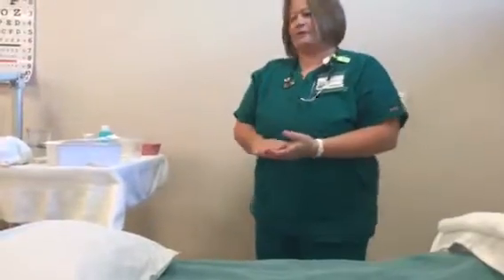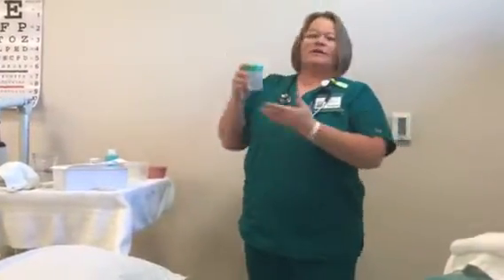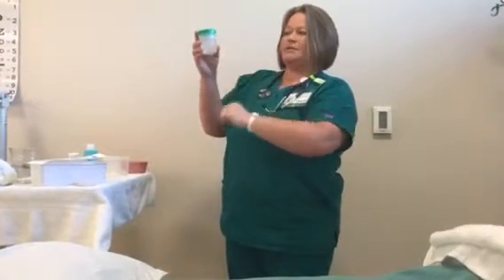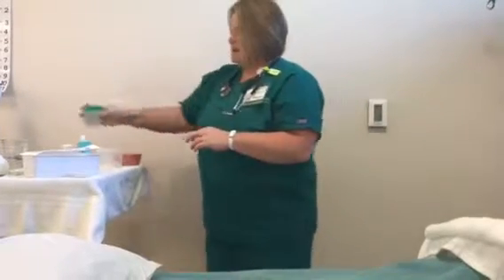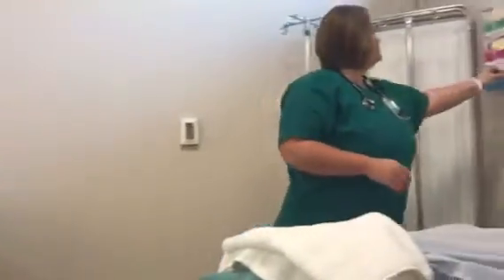I'm going to take a look at my formula. So I'm looking at my formula. I'm looking at the integrity. It looks really good. I'm checking the expiration date. It is not expired. It is room temperature. So I'm going to go ahead and shake that. I am going to go and wash my hands, and now I'm going to put on my gloves.